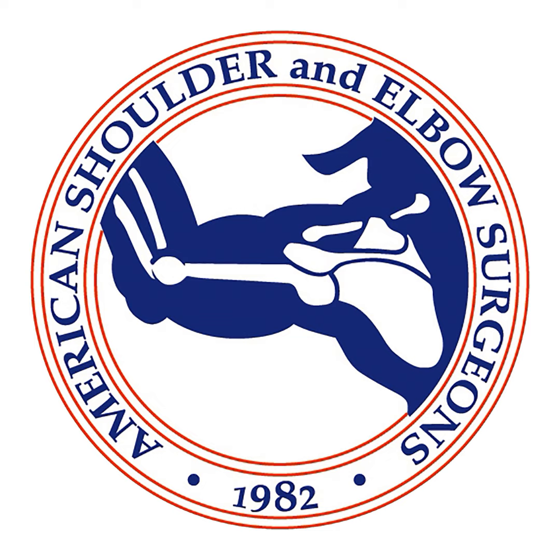Ones that are synthetic but also have biologic properties I find very intriguing and interesting, because that would give you some time zero strength. But then if it can also help promote healing and induce some incorporation into the tendon, I think that sounds pretty fantastic. So I think, like Peter said before, time will tell, and we just need more data points to make sure, number one, that these implants are safe, and that they're effective.